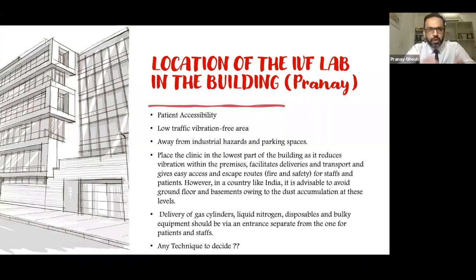And then, like you said, it is a trade-off between what you have and what you want. You can have a clinic in a busy city center or in the countryside, so it is a trade-off between the footfall and patient accessibility versus the air quality. To summarize, it is important that the clinic location is accessible to the patient, with regard to proximity to public transport, parking facility, and especially lift and wheelchair access.